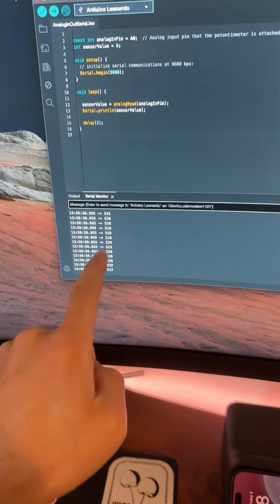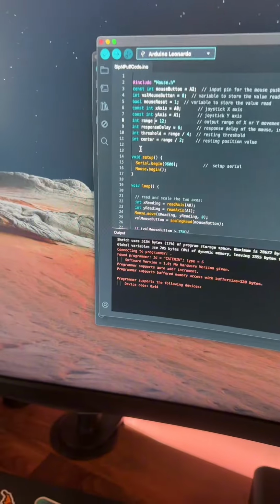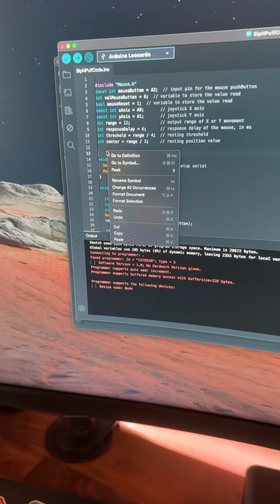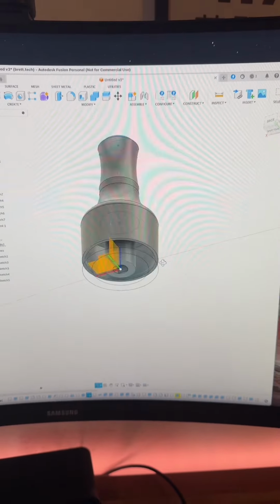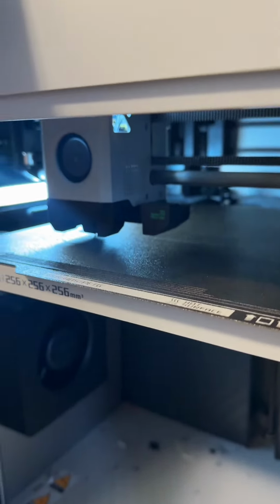Now I'm gonna map those values to clicks on the mouse. Okay, this works so well. So watch this. If I blow on the tube here, it's gonna click and move the cursor. If I suck on the tube, it'll bring up a right click. Now we just gotta put it all together. I've designed this nozzle piece here that should hopefully fit on the end of this joystick. Just gonna send that to the 3D printer. And now we wait.